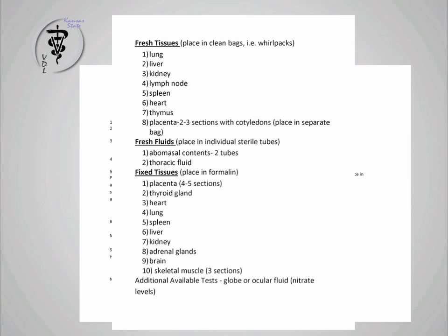And then the other tube we're going to use for bacterial culture. And we do what we call an abortion panel on that, but it's just for the bacteriology portion. So that's going to be a regular aerobic culture, a Campy culture, and a Brucella culture. And that is truly the best sample to do cultures on to try to find any agents. So those two samples, yes.